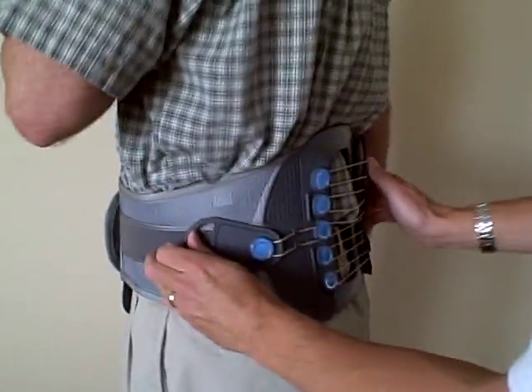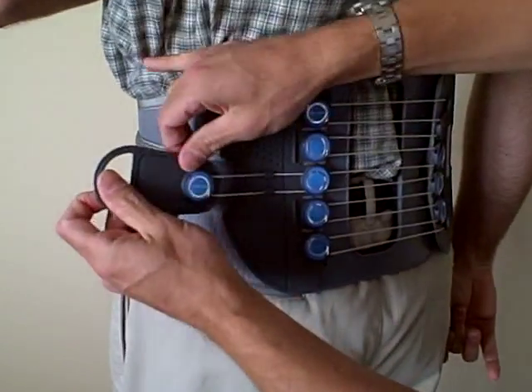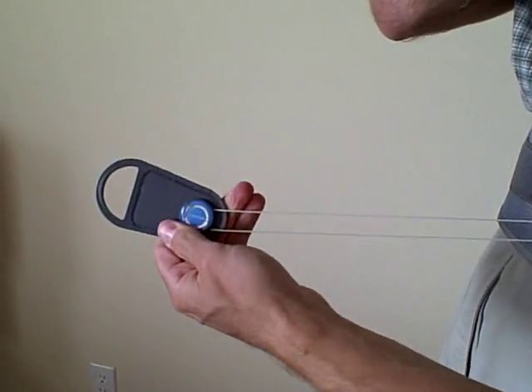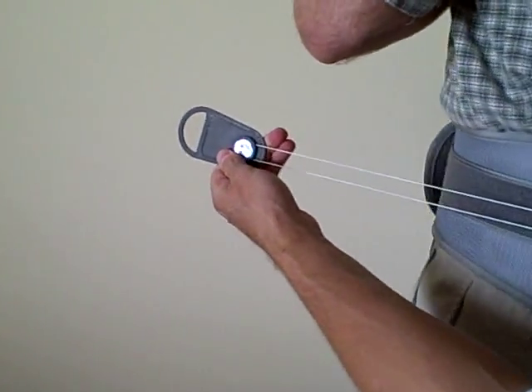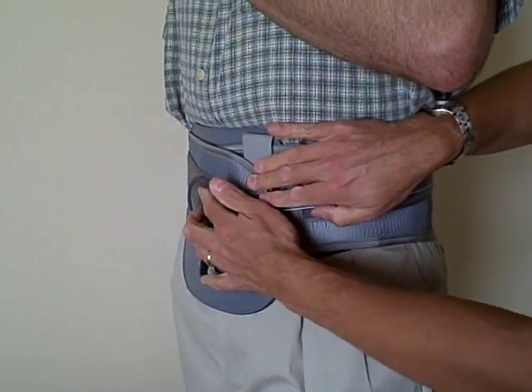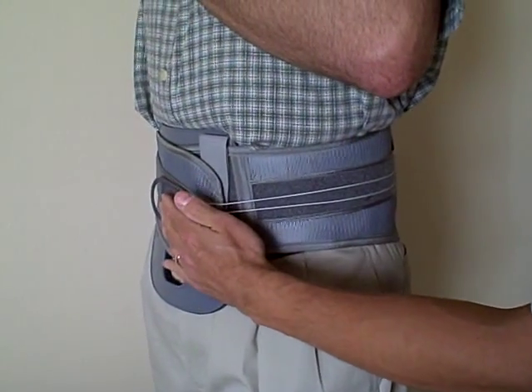On the left side, there's a handle. The handle will control the compression of the back. We'll pull this handle out until we find the desired compression support for the patient, and then simply wrap it around and place it anywhere on the Velcro landing strip that will hold it in place.